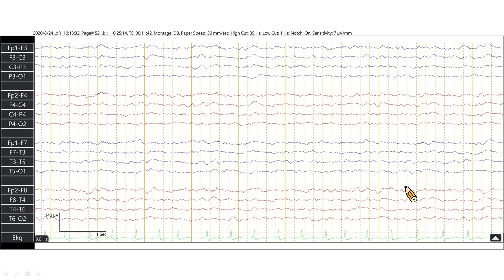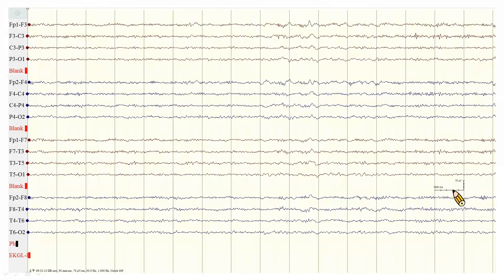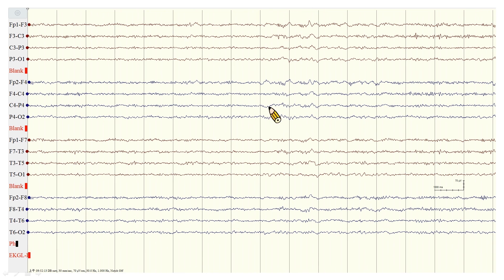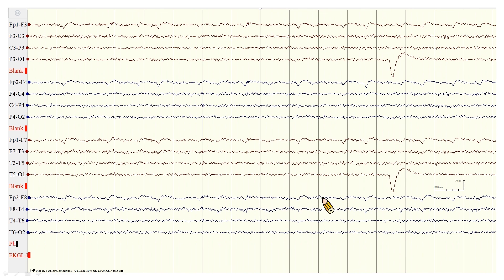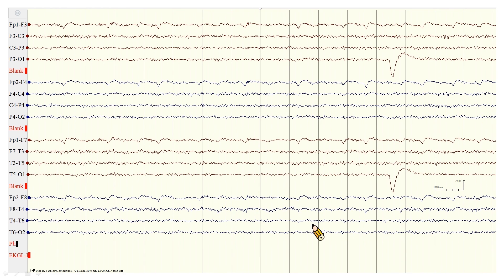Here is an example of diffuse slowing. In another patient's EEG, we can see transient diffuse slowing — but is this abnormal? The posterior dominant rhythm is broken and there is no obvious eye movement, suggesting the patient may be in a drowsy state. After the patient wakes up, eye blinks appear and the posterior dominant rhythm resumes. So when evaluating diffuse slowing, we must always take into account the patient's condition.